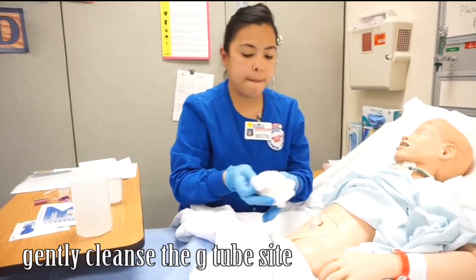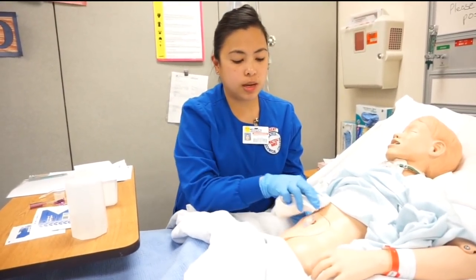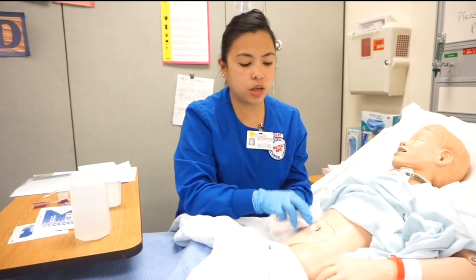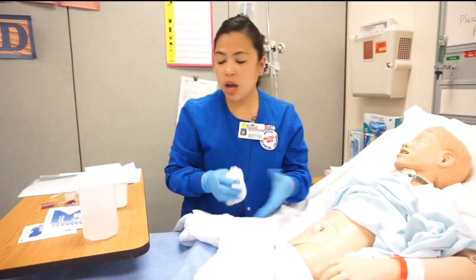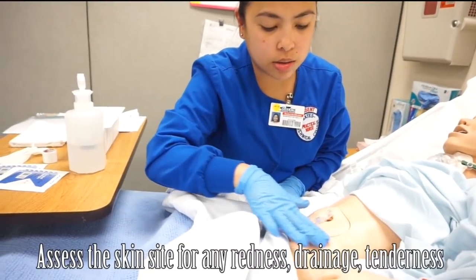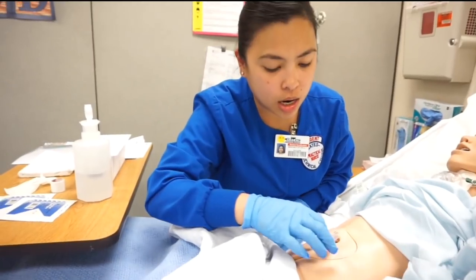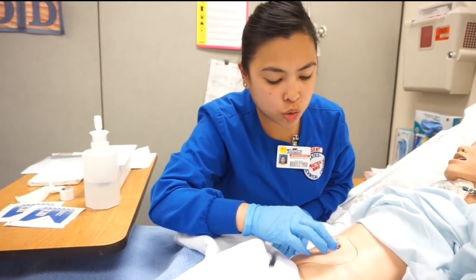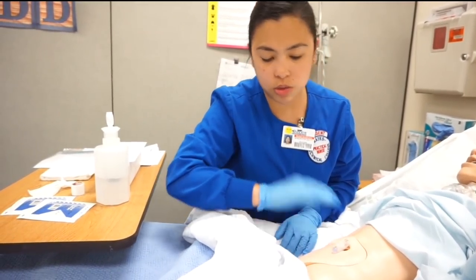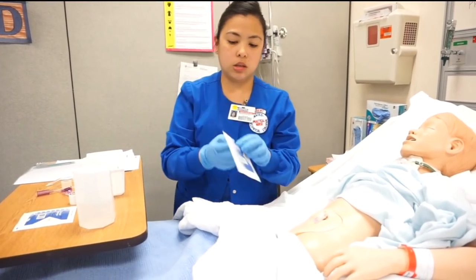Clean the area, and then on the other side I'm going to dry it — don't use friction. Everything looks okay. Now I'm going to check the surrounding area. Everything's good, it's dry. The Mickey tube is still in there and everything looks okay.